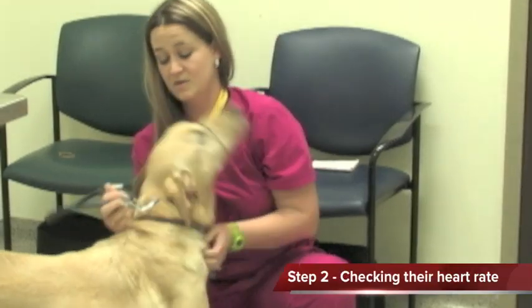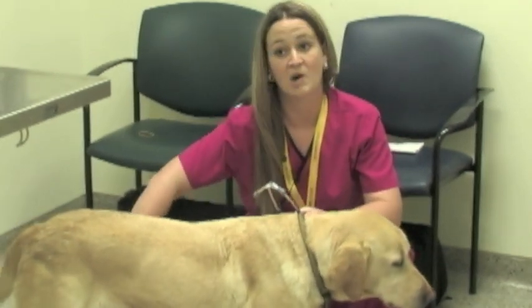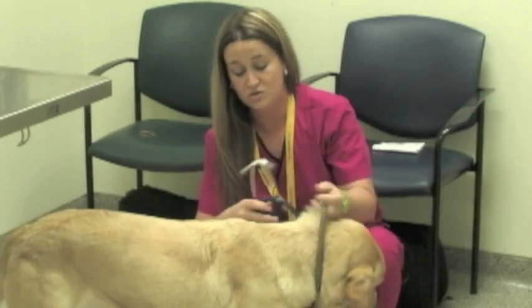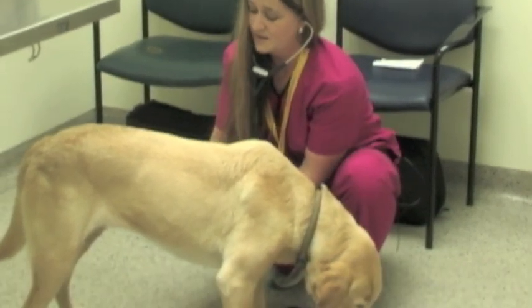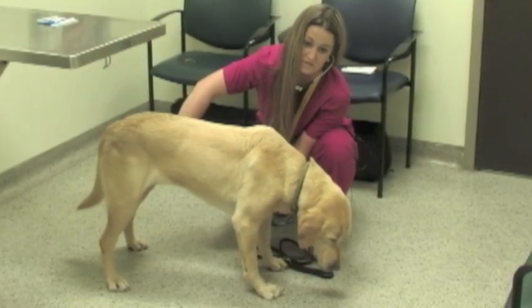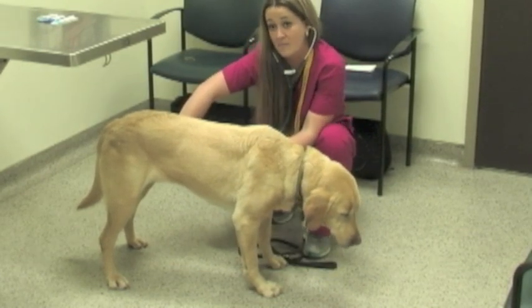The next thing I'll do is go and listen to them. I like to get my heart rate not just by palpating their femoral pulses — I like to listen as well so that I can make sure that their pulses match their heart rate. I'll listen to their heart and make sure the pulses match, that they're equal and synchronous with the heartbeat. I like to count for a total of 15 seconds and then multiply by four.